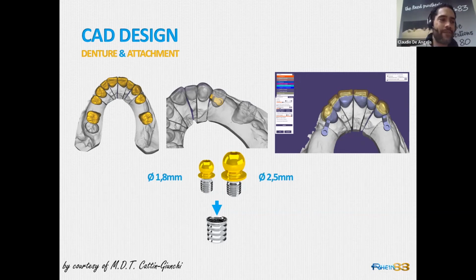Retentive offers a huge amount of solutions, but each of these solutions needs to be applied properly. We have micro and normal size spheres, and we need to first understand which one fits best to the denture. Okay, this is another take-home message I want you to remember today.